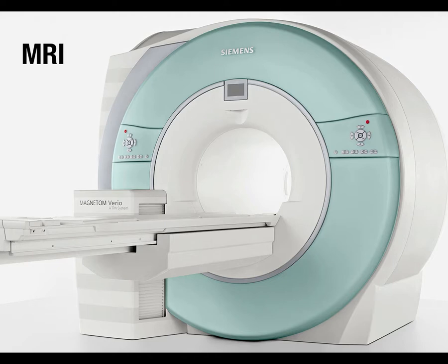The 7 Tesla scanners, the highest field ones, are being used for functional MRI, but probably the more popular application is actually diffusion imaging, where you're measuring white matter tracts, because it allows you to get higher resolution images. And the 7 Tesla seems to be necessary to get the level of resolution that we really need to resolve human white matter tracts.